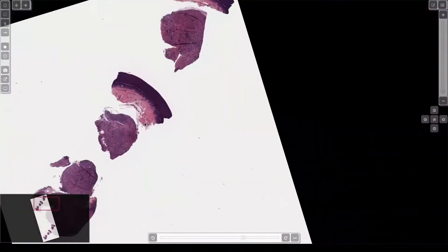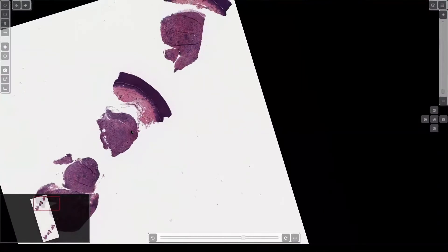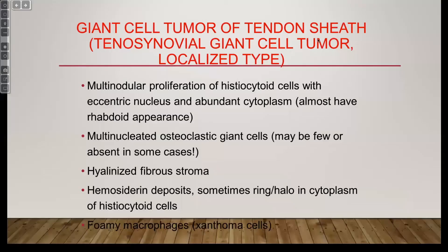Most of the time you do not get any skin with these. This surgeon was nice and included the top of the skin, but they're rarely ever in the dermis — almost always below the subcutis or tendon sheath. They do always attach to the tendon sheath, but can present as a subcutaneous nodule. Giant cell tumor of tendon sheath — the other name for this is tenosynovial giant cell tumor, localized type. There's a diffuse form, which is large and usually in the knee and sometimes villous — that's called pigmented villonodular synovitis.